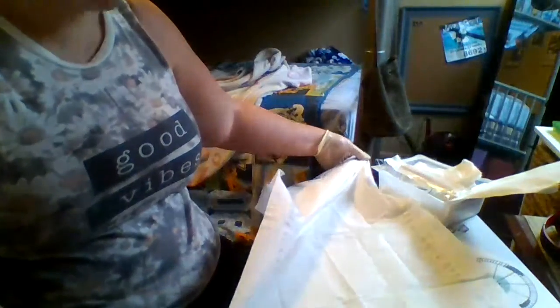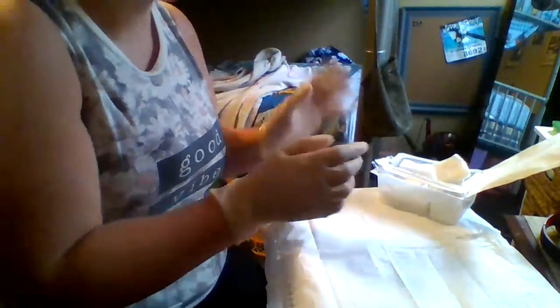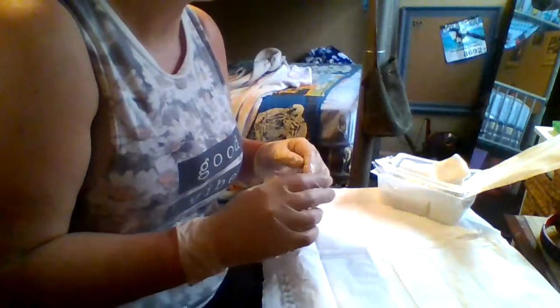My table's not really big enough for all of this. Okay, I'm just gonna pretend. We're just gonna pretend that would be off to the side or something. So now what we need to do is place our things just so we can clean the wound.